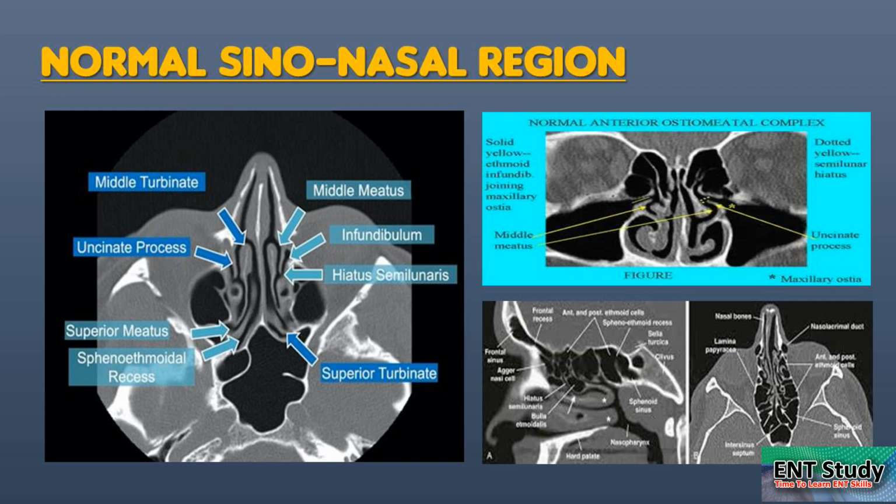The greatest help we have is that from the nose till the larynx, the anatomy is symmetrical.